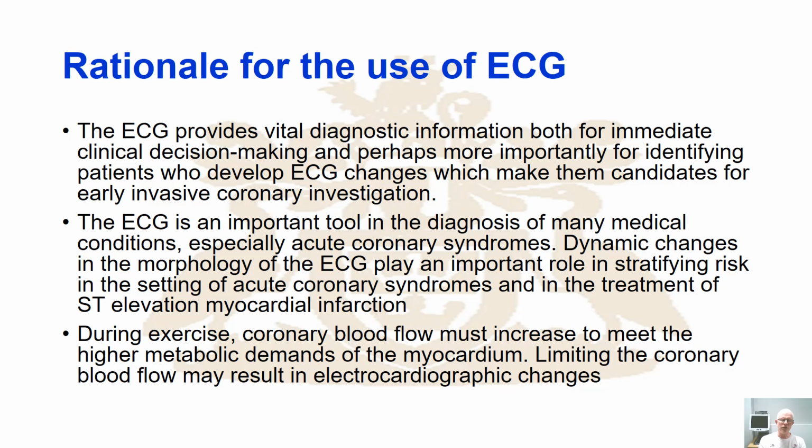Quite often what happens is that we think about the heart and stress being placed on it, and we think about the myocardial infarction. But the beauty with exercise is you can place the heart under stress under reasonably controlled conditions. This is the classic ECG test, where you do an incremental test, like a VO2 max test, to exhaustion, monitor the ECG, and compare the ECG response to what would be anticipated, and therefore you can start to make a diagnosis.